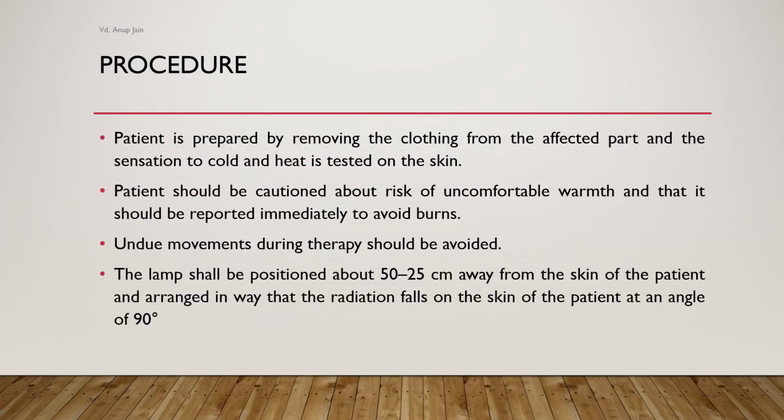The procedure of performing infrared therapy is quite simple. At first, the patient is prepared by removing the cloth from the affected part, and the sensation to cold and heat is tested on the skin to prevent any kind of damage. Patient should be cautioned about the risk of uncomfortable warmth and that it should be reported immediately to avoid any kind of burn. Patient should also be advised to prevent any undue movement during the therapy so that maximum results can be achieved.